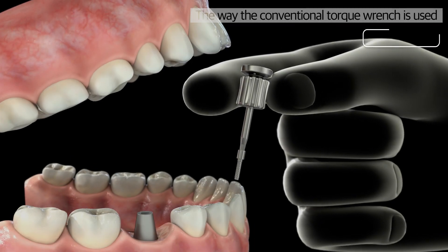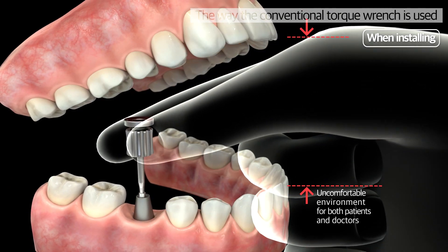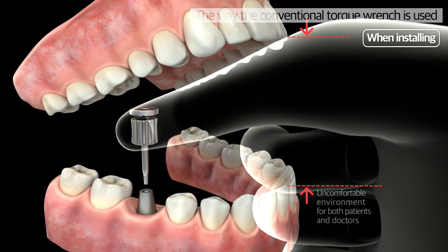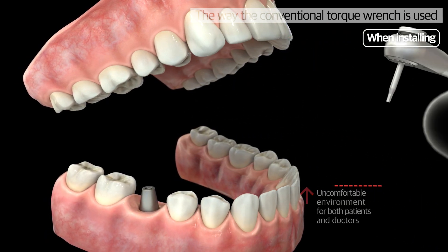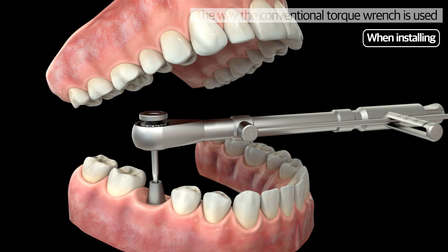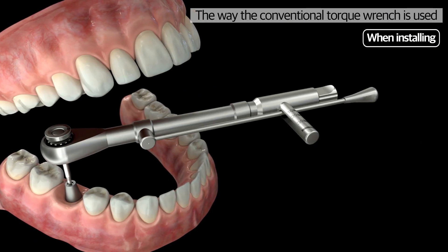Conventional torque wrenches require practitioners to put a hand in the patient's mouth when using them, which increases the difficulty and discomfort when a patient has a small mouth or a dentist has a big hand. They also have various disadvantages, including the discomfort of using two pieces of equipment as well as the risk of swallowing a hand driver.